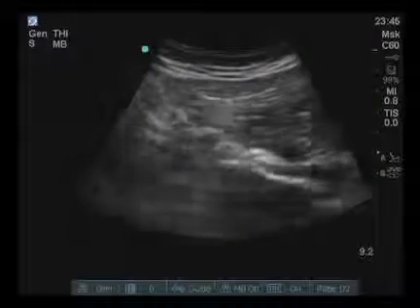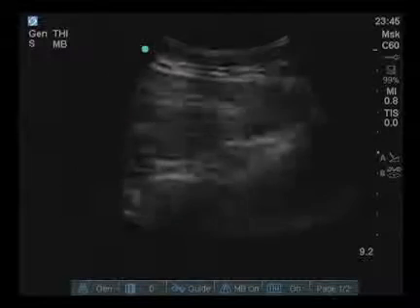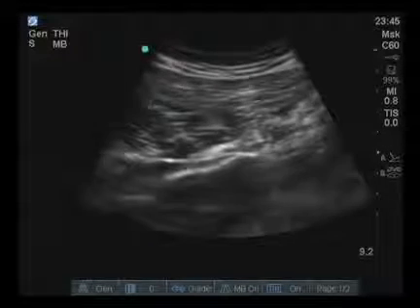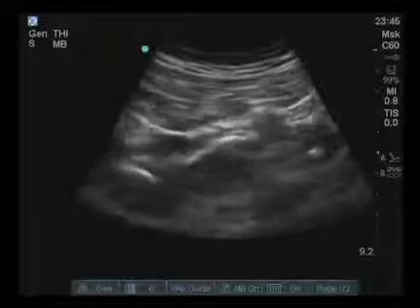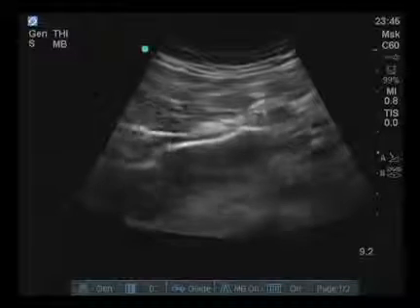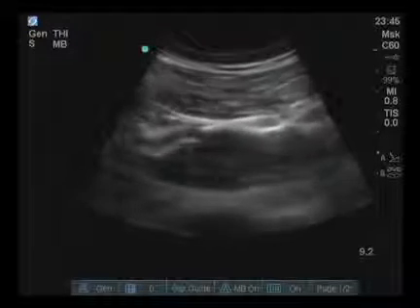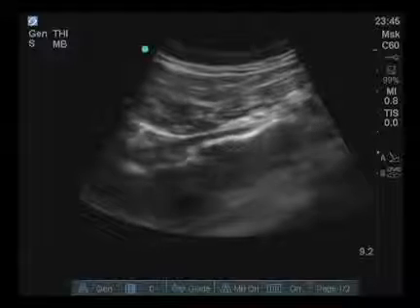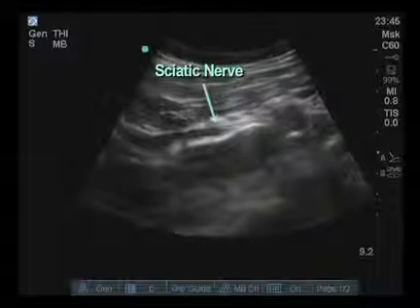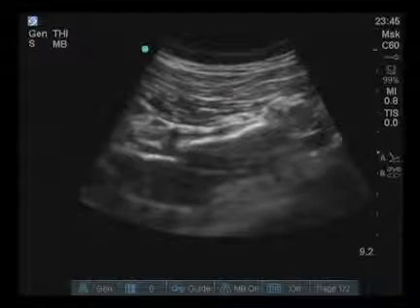The middle portion of the gluteus is identified, and then in a transverse or left-to-right positioning, the probe is placed in contact with the skin. The leg in question can be mobilized in an abduction-adduction maneuver, demonstrating motion of the piriformis muscle as it inserts out towards the greater trochanter and towards the ischium centrally. Clearly in the middle of the screen, you can also identify the sciatic nerve as it passes very close to the fibers of the piriformis muscle.